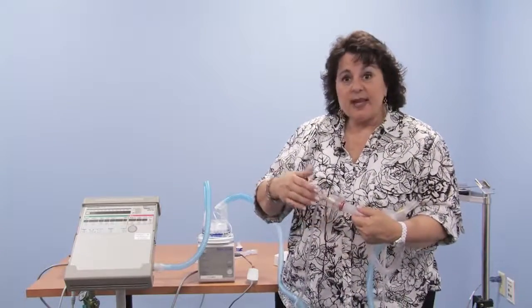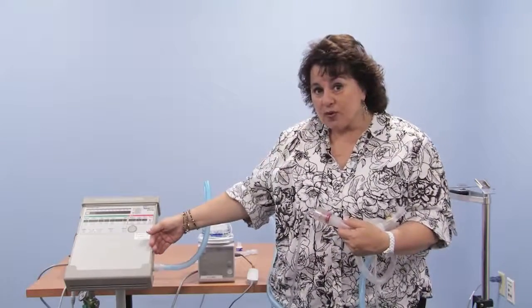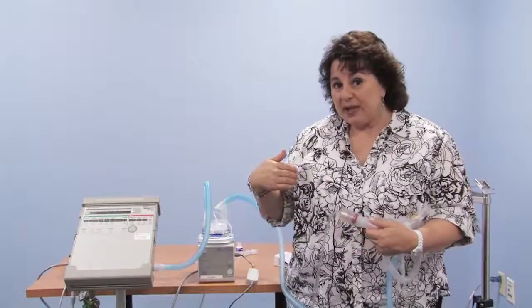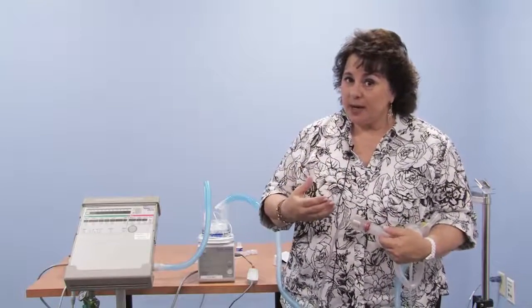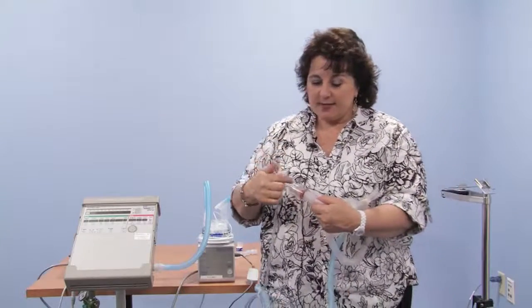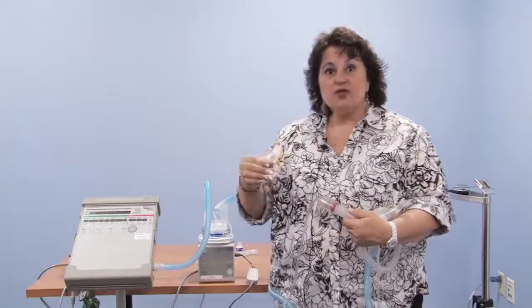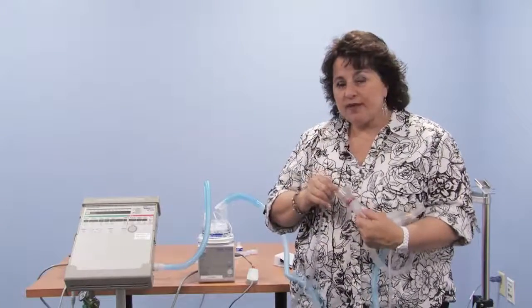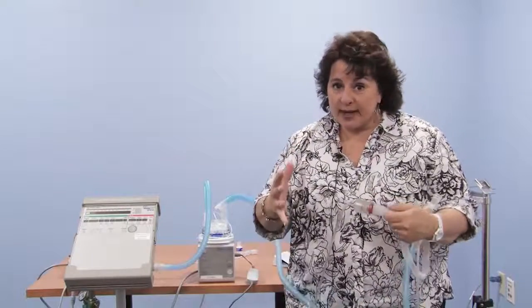What I'm concerned about is that now that the companies are starting to transition from the 950 with PEEP on the hose to the 1150 with PEEP now on the machine, if by accident your DME company sends you this type of hosing and you have the 1150, you cannot set 5 of PEEP on this one and 5 of PEEP on the machine. That will give your child 10 of PEEP. So that is a precautionary thing to think about. Make sure you have the right circuit for your ventilator when you set up the ventilator for your child. When companies are managing both brands, it is possible that you'll be delivered something that isn't correct for your machine.